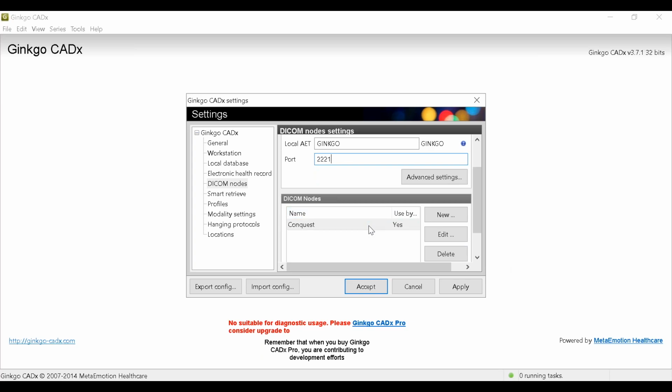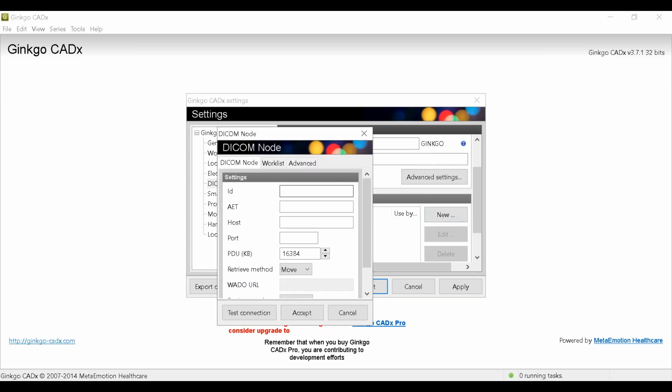We're moving along. Notice here it's got the actual node. I'm going to go ahead and click down here. Notice you could have clicked new. I'm going to delete that. We're just going to go ahead and add a new. Notice I go to new here and it asks me for an ID. Now here's what's interesting. This ID could be anything I want to call it. It could be whatever I want the person using this Ginkgo CAD to see. I'm just going to say ConQuest. Why? But I could say this, come to think of it.